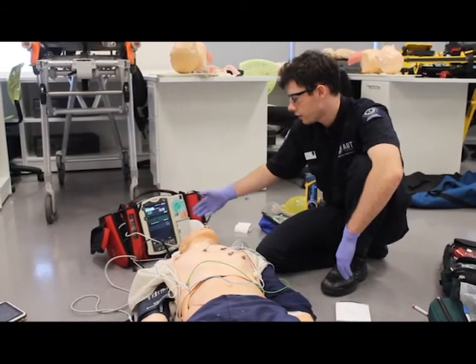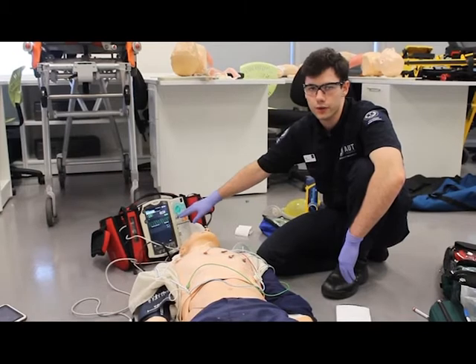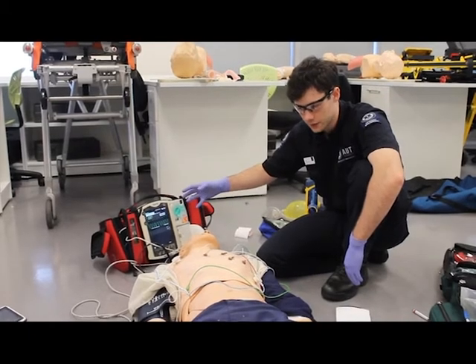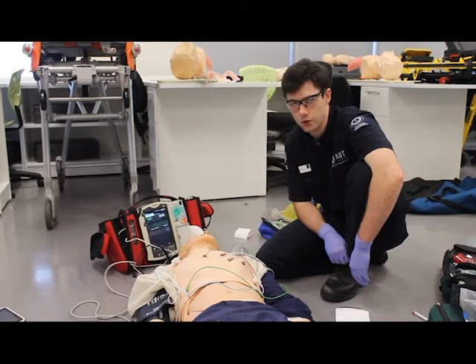If I was to re-cardiovert, I just have to double check that I have resynced on the monitor, so that every cardioversion shock I deliver is synced with each of his QRS complexes, and double check that with a printout each time just to make sure.